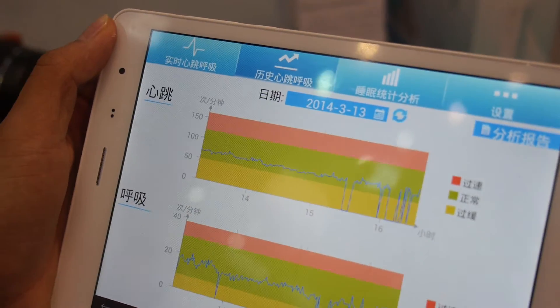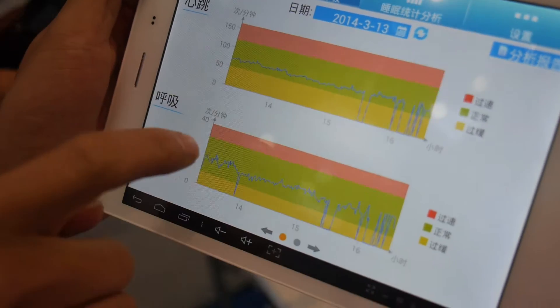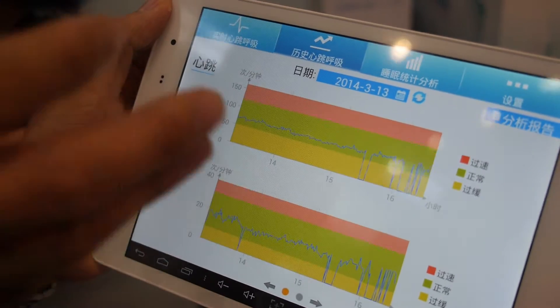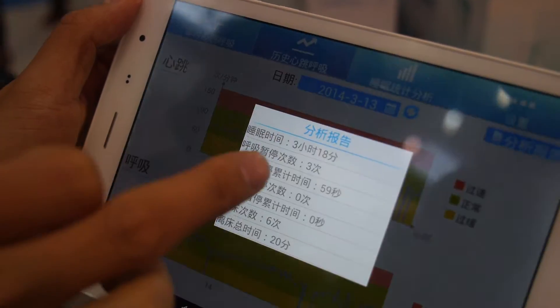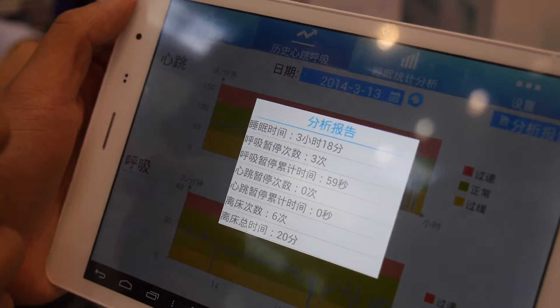Here you have the record of the whole night's heart rate and breathing. You can see from the record at what time you left the bed, at what time you stopped breathing. And here is a report about how long you slept and how many times you stopped breathing.